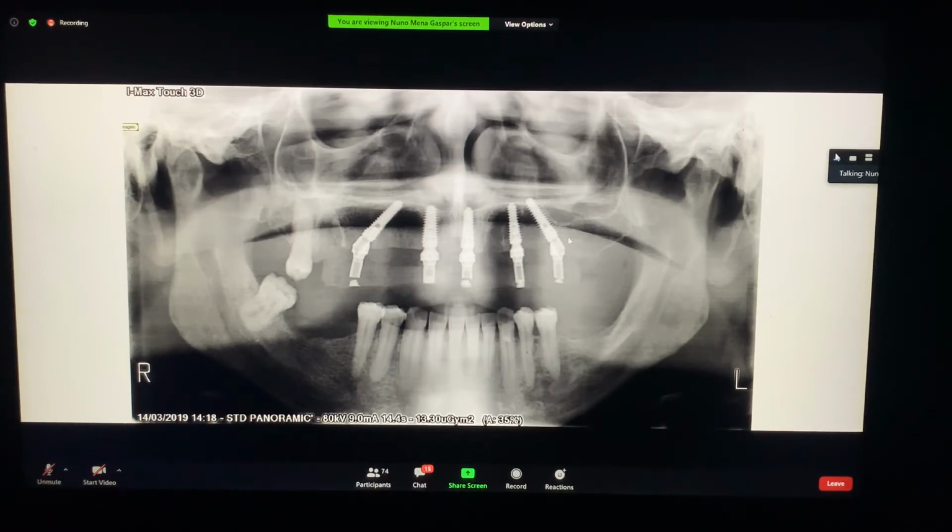Yes. But to give a quick answer to that, the Enerich implant design may look very aggressive, but on bone it's very gentle. The thread designs are like knives, so they progress on the bone without crushing it. That's why we can start our final prosthesis at 4 weeks.